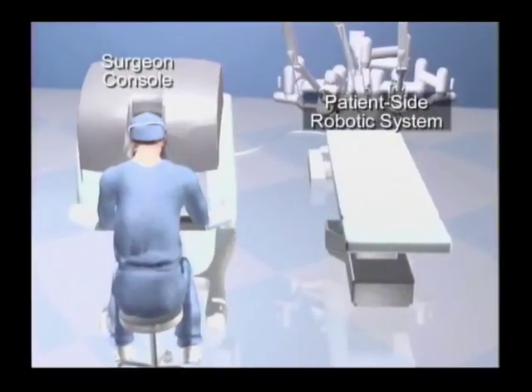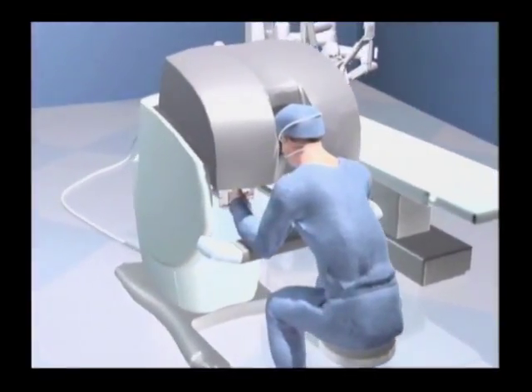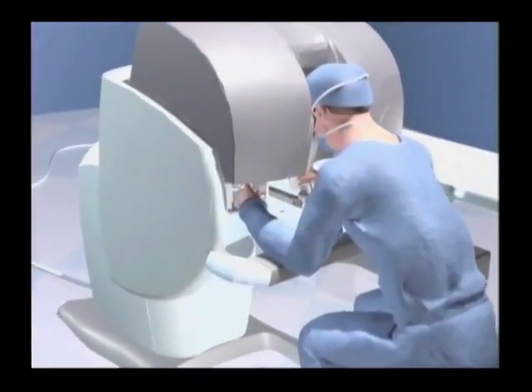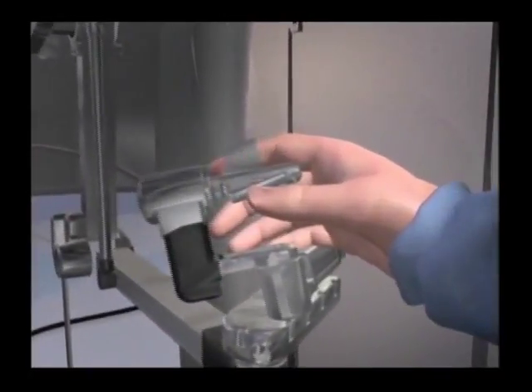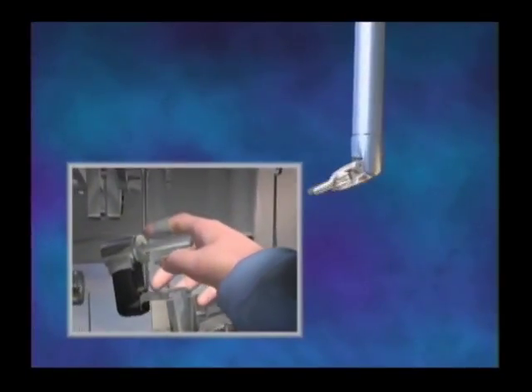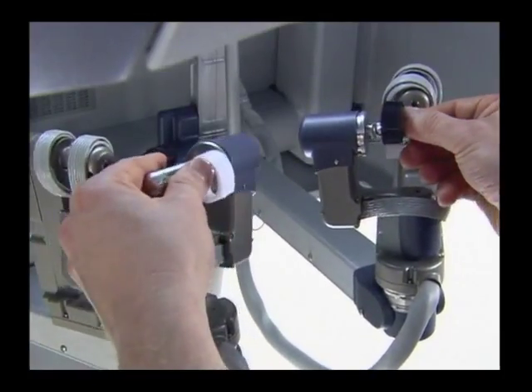Once a patient decides that she does want to proceed with hysterectomy, there are several different methods that we can do it. We can do it abdominally, which is the traditional method. We can do it vaginally, we can do it laparoscopically, or we can do it with aid of the Da Vinci surgical system. The benefit to the physician, we can definitely operate with more skill, more accuracy, and improve the surgical technique that's performed. We can minimize our bleeding. We can do these surgeries with 1/3 less bleeding than we can with the traditional route.